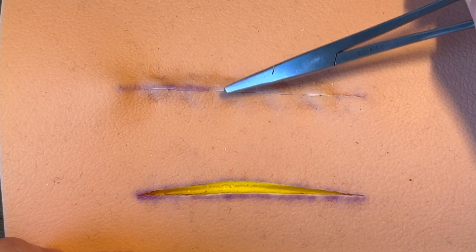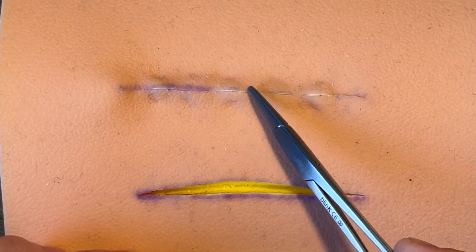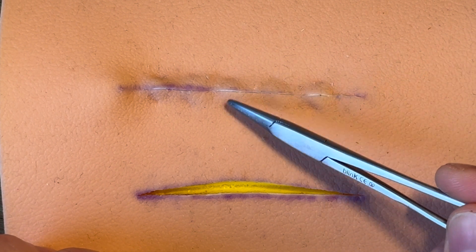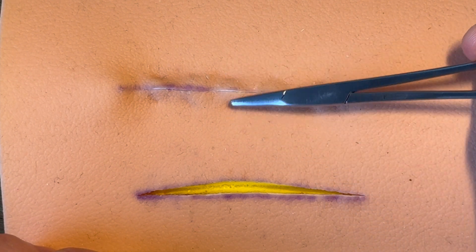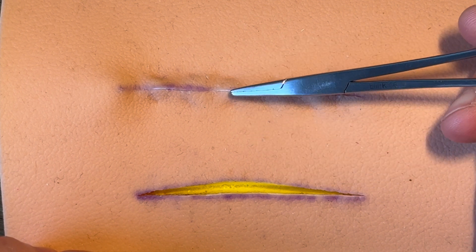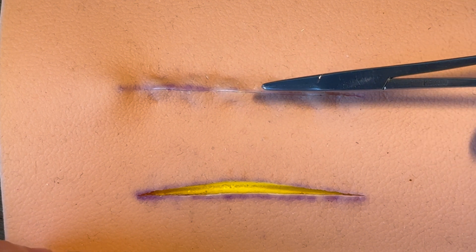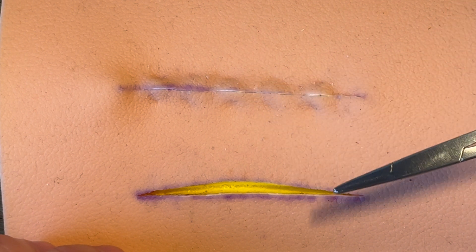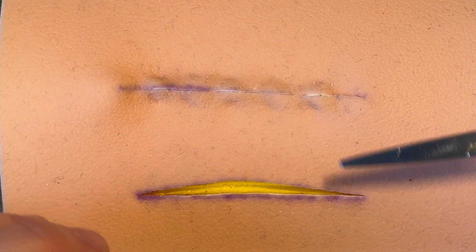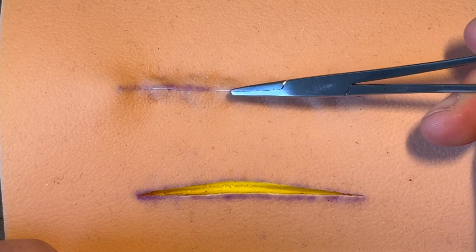You get these little dimples either side, which takes the tension off the cut bit where the scar's going to form. If you get that pulled together from just a little bit back from the cut edge, then that's going to leave this nice and loose so that you can close it easily and do just fine leveling on the surface with normal sutures, glue, or whatever.